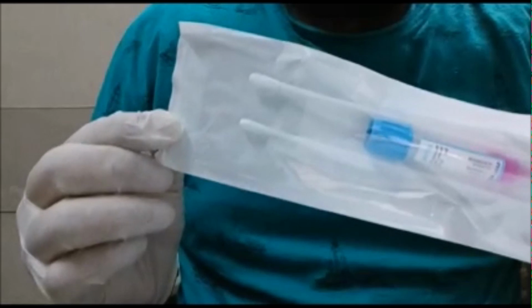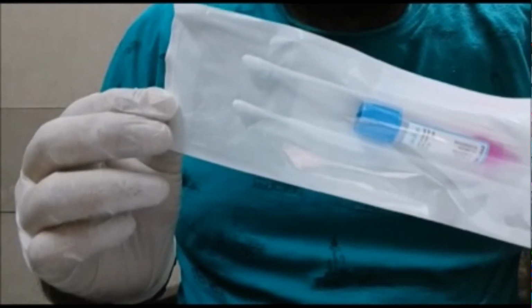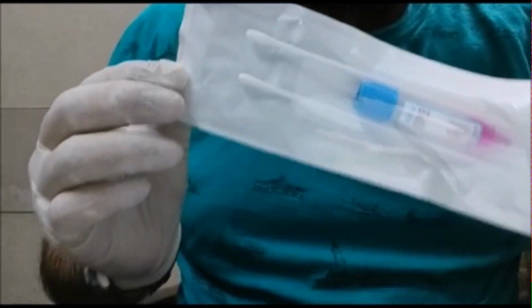It's a specimen collection tube with 2 swabs. I'm just trying to give you a demo. How do the swabs break after taking the specimen collection? Okay. This is a tube.